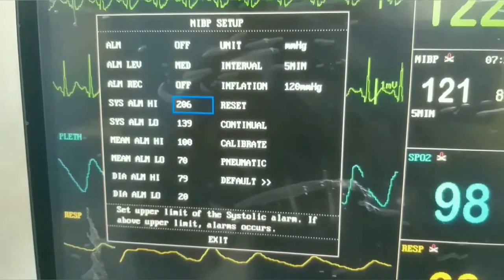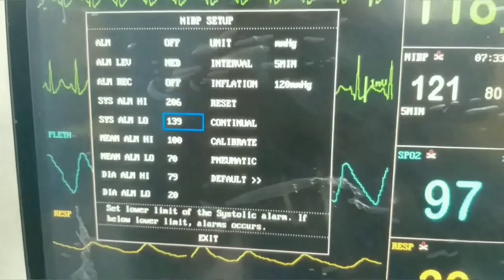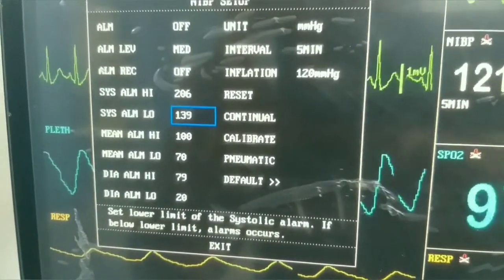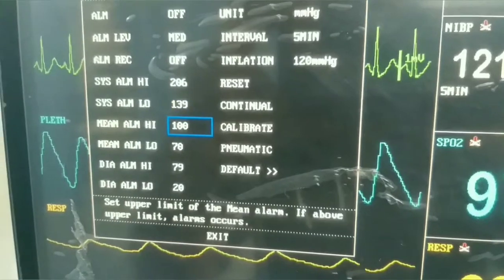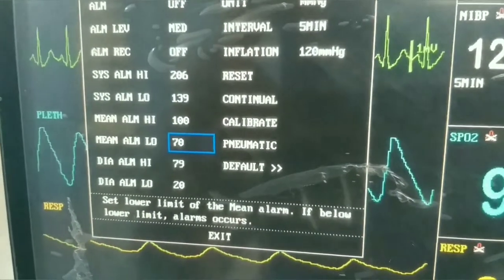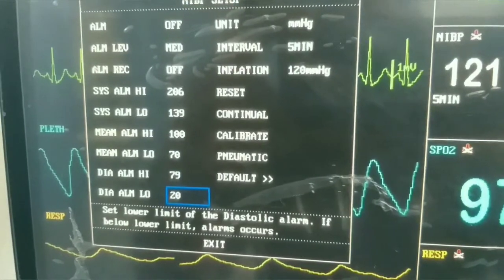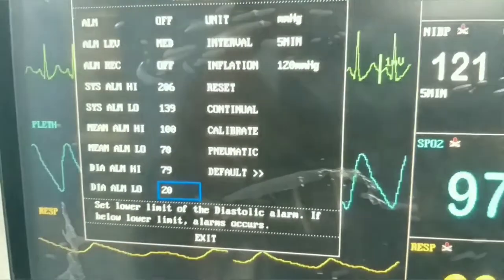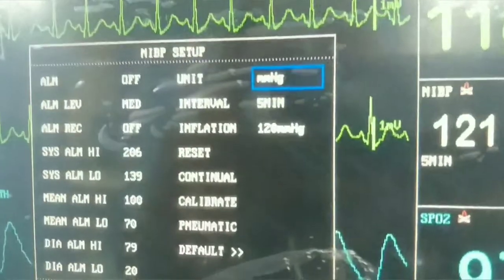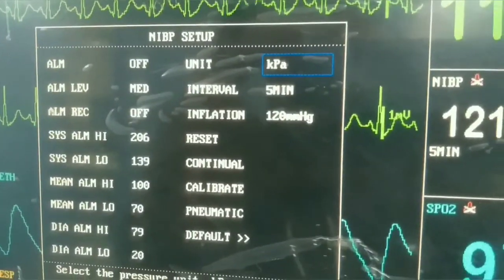Now we open the menu setting of the NIBP. There are certain options we can engage and change with the help of the knob, which we rotate clockwise or anti-clockwise, then push in to engage the setting. These include alarm settings and unit settings — the unit is millimeters of mercury.